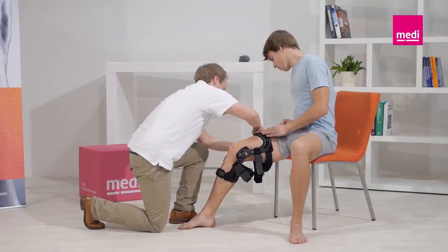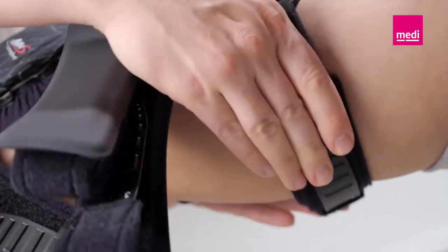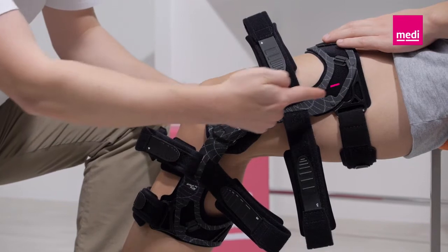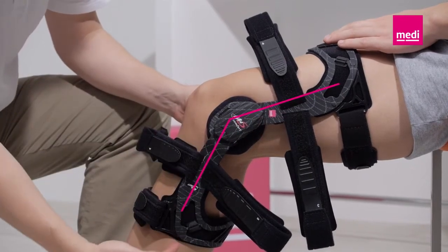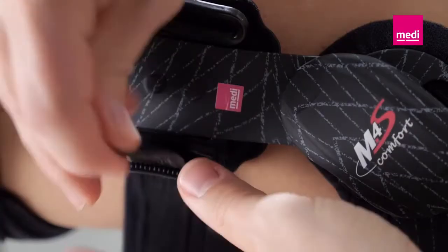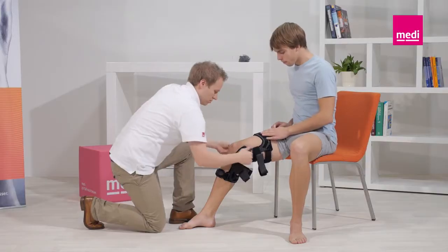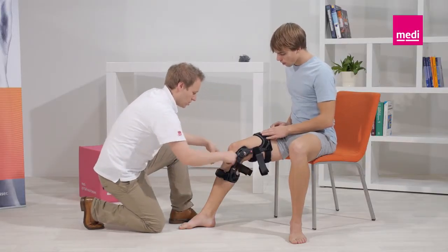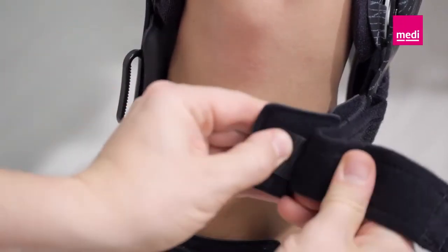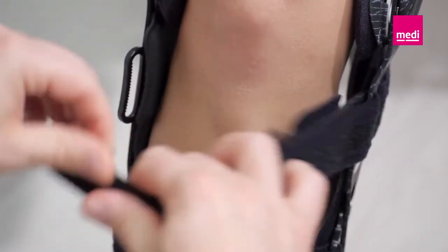Start with straps 1 and 2. The knee should stay bent. Now push both orthosis hinges backwards towards the back of the leg. Make sure that the hinges are positioned behind the lateral medial midline of the leg. Now fasten straps 3, 4, 5 and 6. Please note that the pads on strap number 4 are split. These can be positioned around the scar if needed in order to avoid unnecessary pressure on a possible surgical scar.